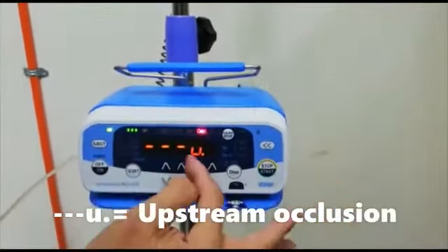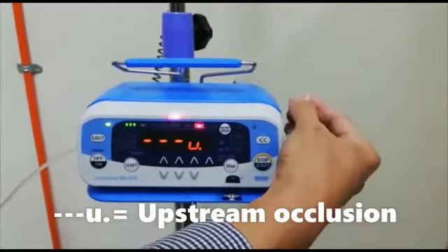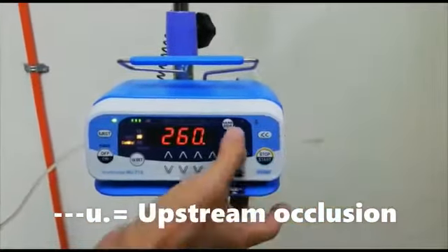Sorry, just now was downstream, lower. This one is U, for up, upstream. Same thing, you just silence it. Then you rectify the problem, and then start.